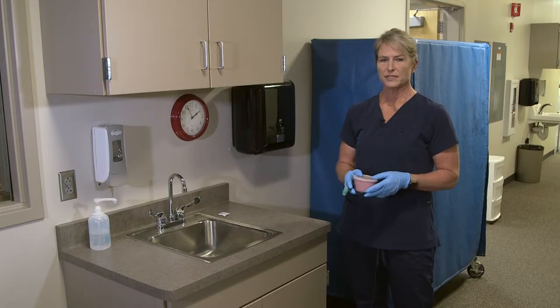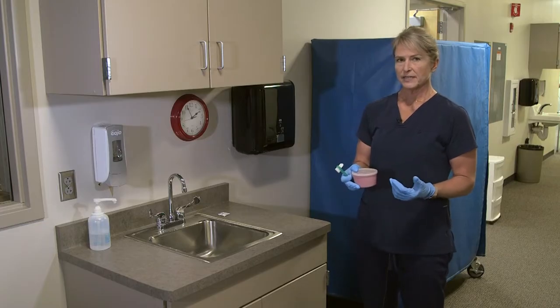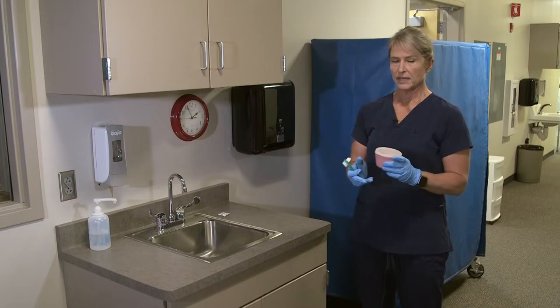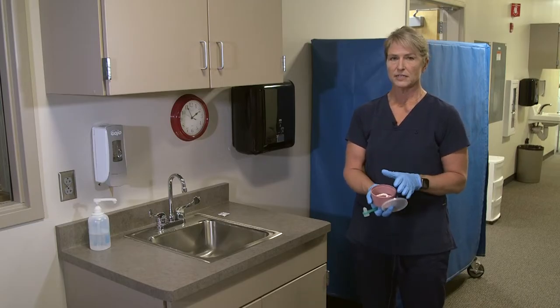For denture care, we would need the resident's dentures and a denture brush. I have already sanitized my hands and put gloves on, and I got the dentures from the patient. We would put those in a denture cup.